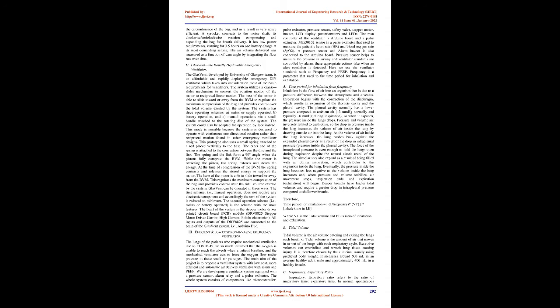The design of the device and software was governed by ISO standards. The system implements 2 modes, controlled mechanical ventilation, CMV, and inverse ratio ventilation, IRV. A user can control breathing rate, tidal volume, and inspiratory/expiratory ratio. All the mechanical components were developed in open-source CAD system. A backup battery enables short-term patients' mobility, and safety protocols and software provide alarm when the monitored proximal pressure exceeds the permissible range, or the pressure sensor is disconnected.